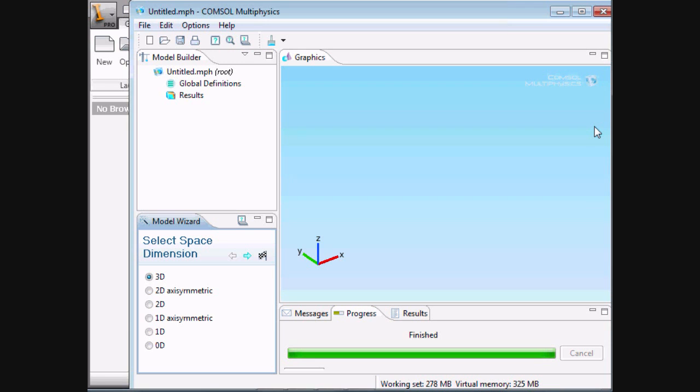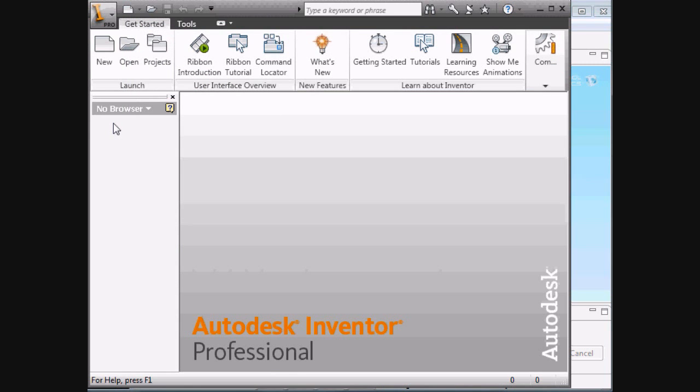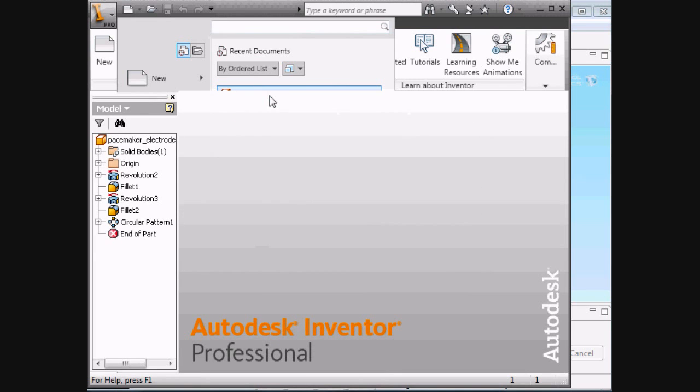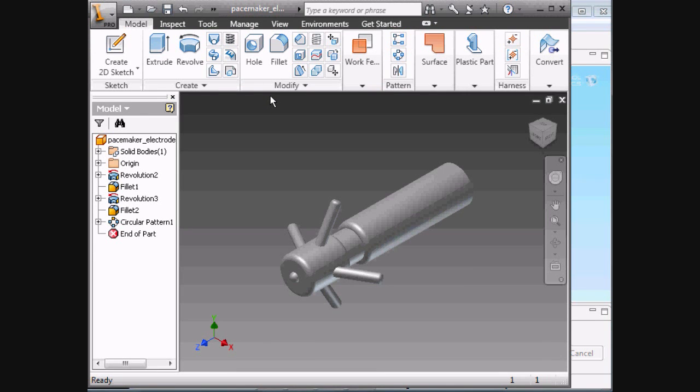In order to use the LiveLink interface, we have to start up COMSOL and have the CAD program running at the same time, which in this case is Inventor. The first thing we do is to load a CAD file, and in this case we're going to load the pacemaker electrode file, where we have a voltage source and a ground on an electrode.